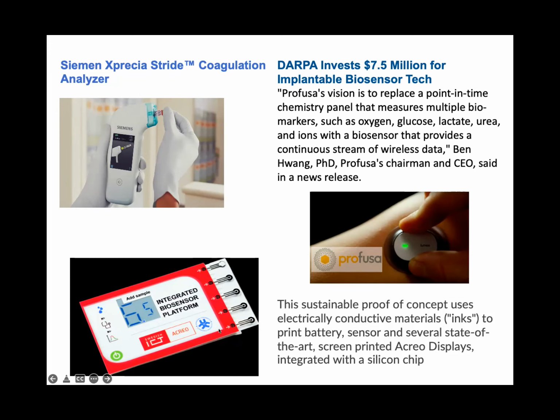And this one, at the size of credit cards, debit cards, you can see that obviously there are electrodes. Here they have multiple analytes that can be analyzed at the same time. So you have glucose, you have cholesterol, or some other important ones that you have to test.